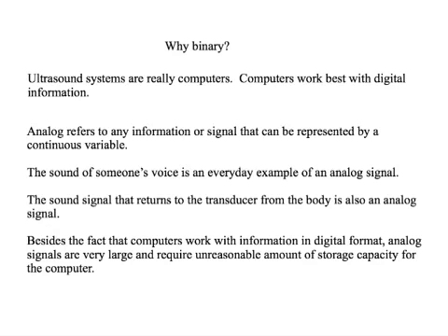This video is about the binary system and why we use it with ultrasound. The binary system is a way to store digital information. Ultrasound systems are really just computers. Computers work best with digital information.